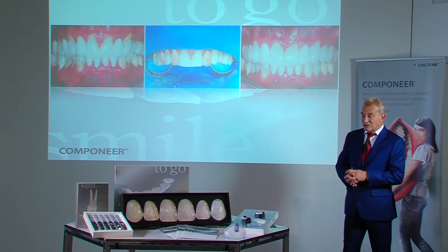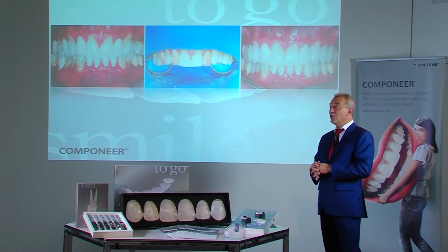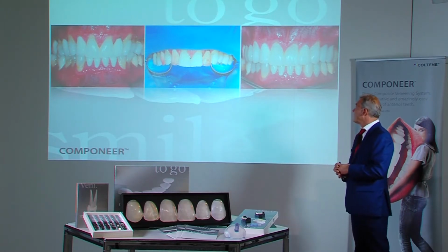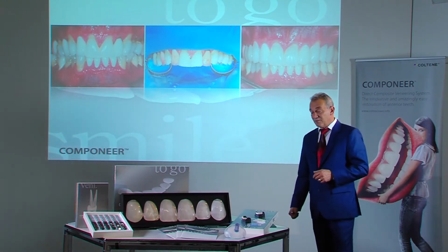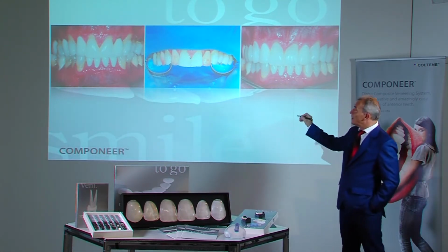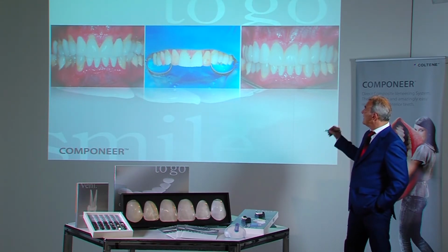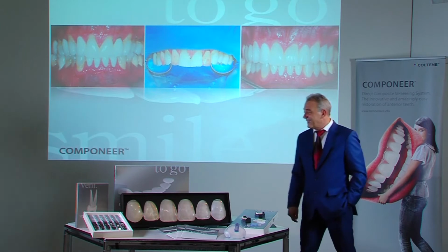This is particularly important in patients with bruxism who have a tendency of grinding their teeth via the incisal edges. The likelihood of chipping or a defect is simply greater than with natural enamel. But as long as we inform the patients, this is not a problem. The crowns were treated with a 4.9% hydrofluoric acid, etched with ceramic etchant, silanized and bonded. This allows restoration of the contours and protection of the teeth for a certain period of time.